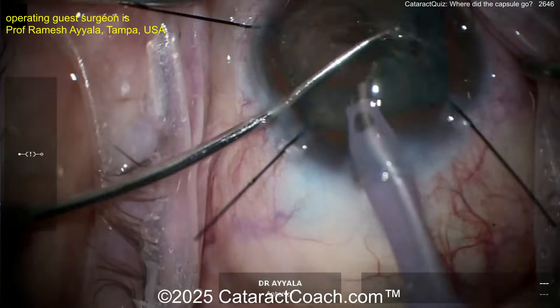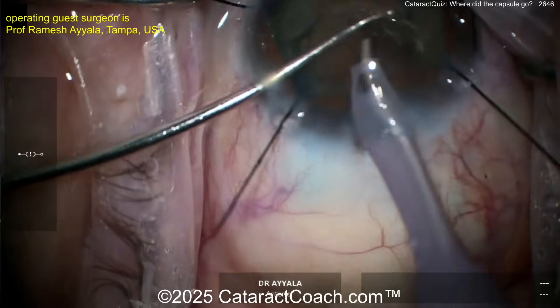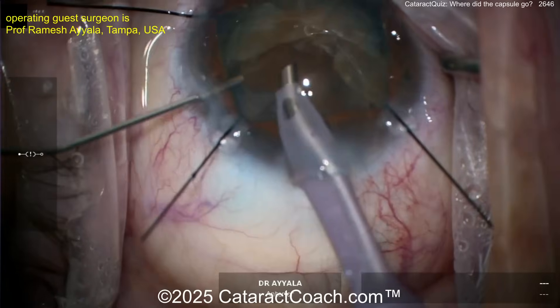The nucleus removal goes pretty smoothly. It's a pretty dense cataract — these can be tough. Remember there's much less working room, and it's a very large nucleus in comparison to the short axial length. The axial length is 17 millimeters — this lens thickness can be almost five millimeters thick.